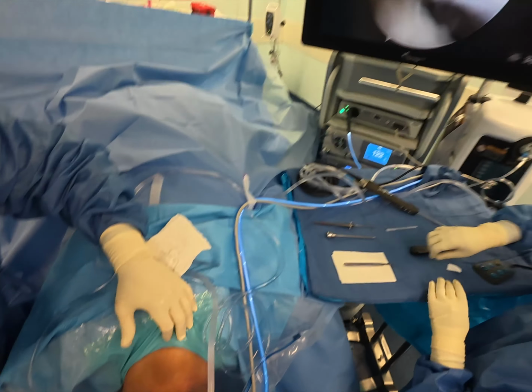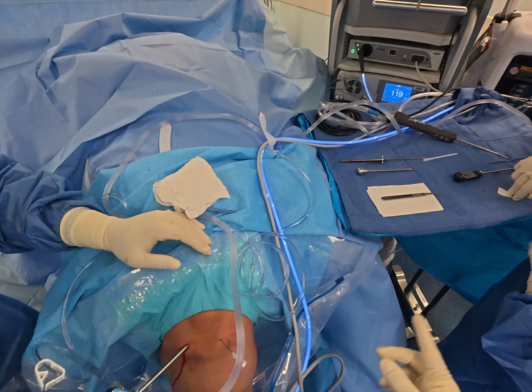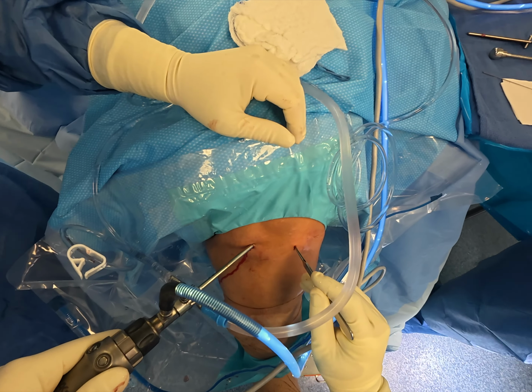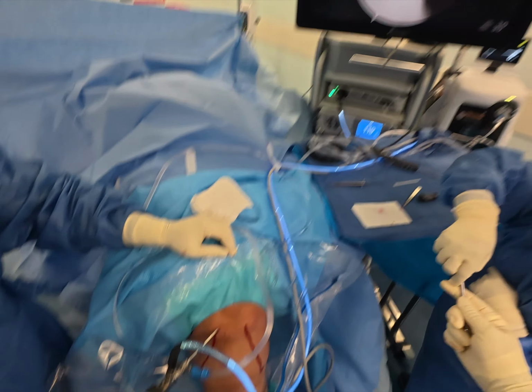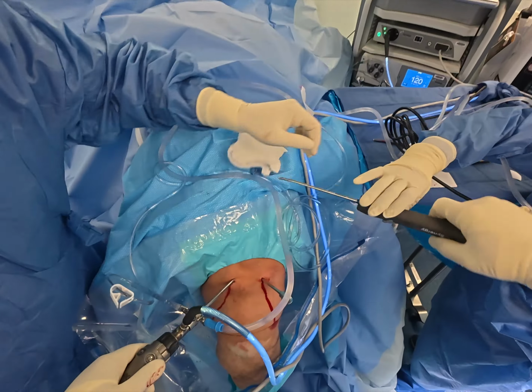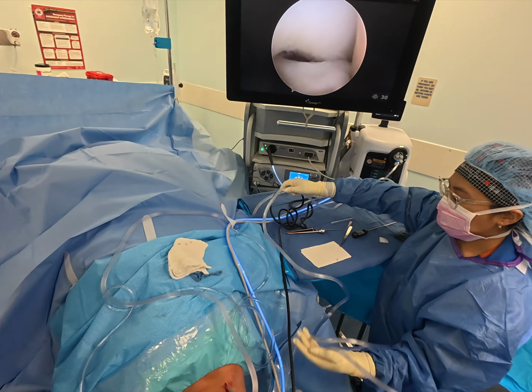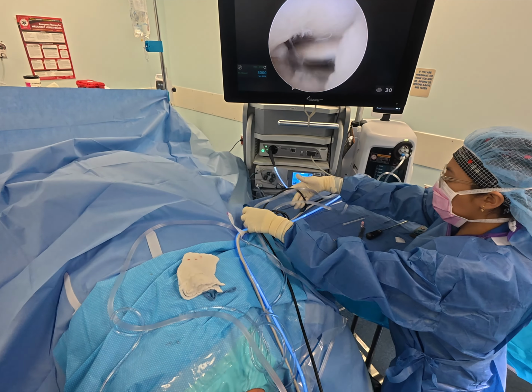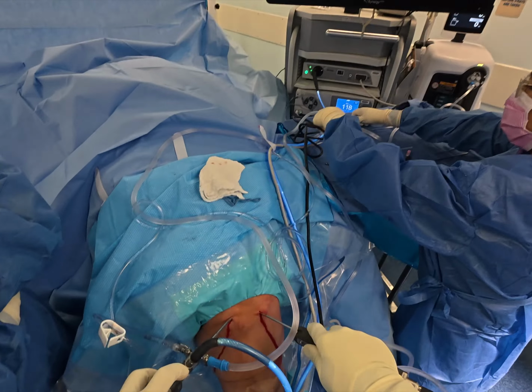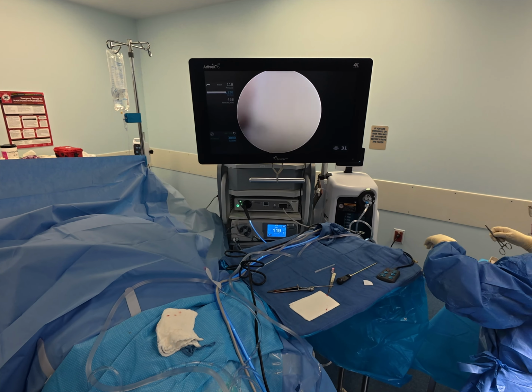So here we go. Going in with my needle, 11 blade. Careful, careful. Short blunt and shaver. So this is synovial tissue. I'm just going to excise this stuff. That's not the lesion that I saw in MRI. So we're going to find it. Got to get all this stuff out of my face.